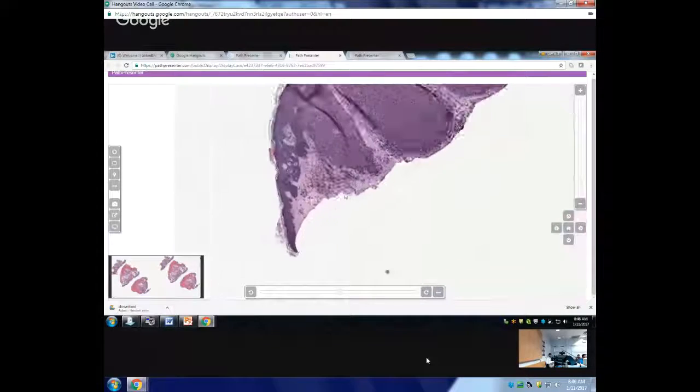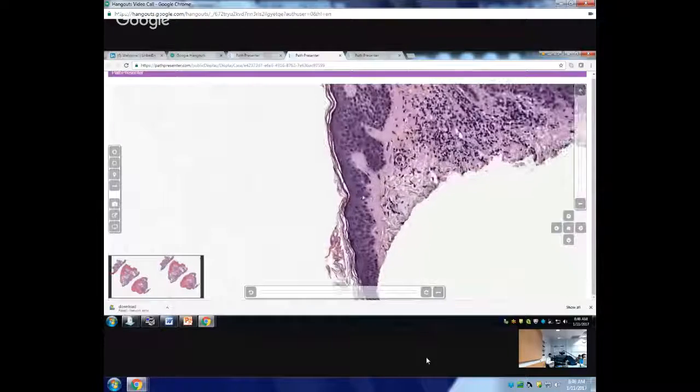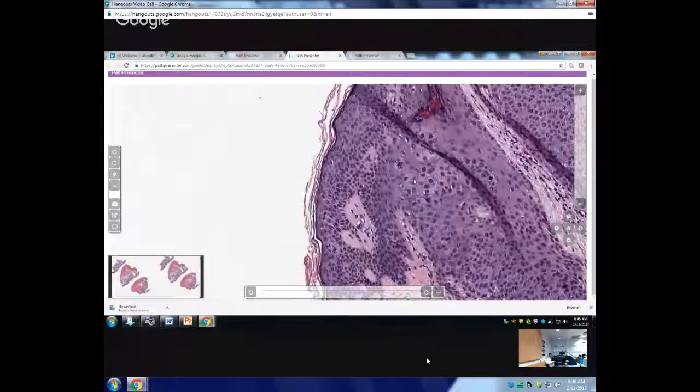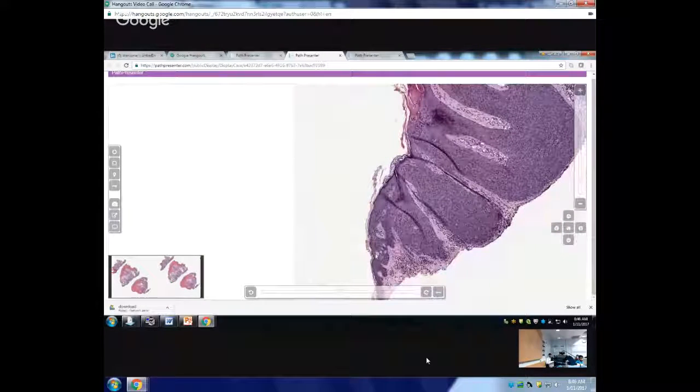Look at this epidermis here. This is normal epidermis, and then suddenly you see the growth pattern, atypical. That is not a feature of squamous cell carcinoma. Squamous cell carcinoma cannot have very sharp demarcation between normal and atypical. You'll see atypia, then you'll see an AK at the edge, and then you're going to see the normal skin. Here there is no AK at the edge.